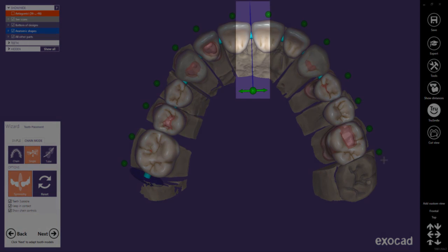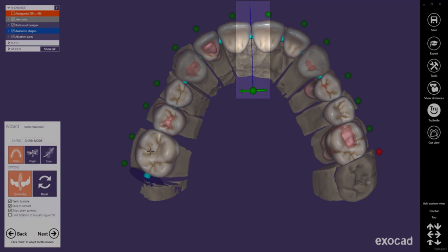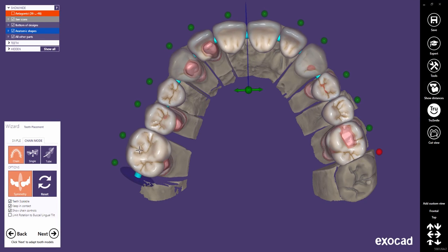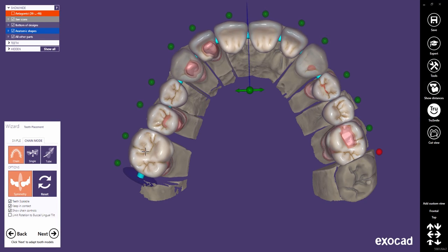Important note: as long as the control point for the symmetry plane is green — not locked — the plane may change its position within the tooth bow.